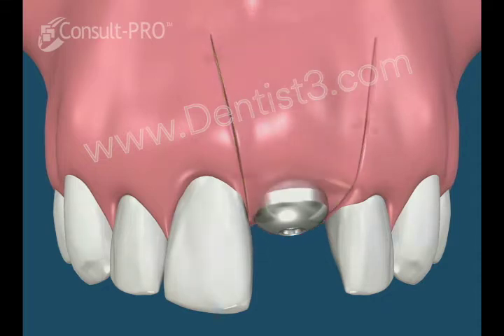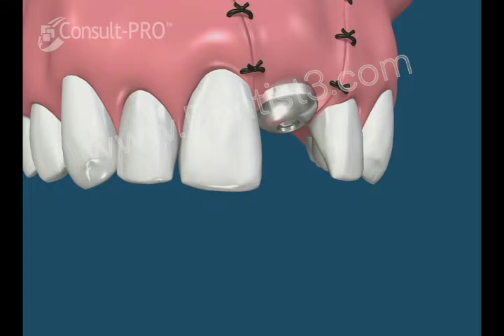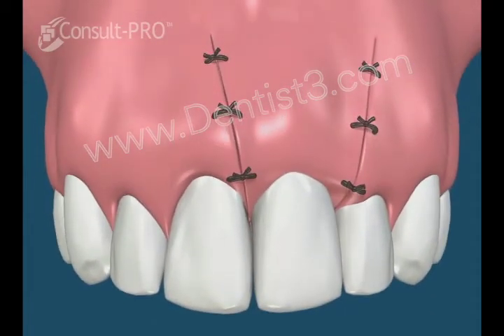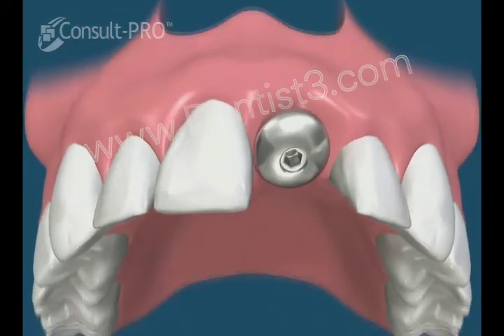The gums are repositioned and sutured into place. The provisional denture can still be used at this time. The sutures are removed or they will resorb.